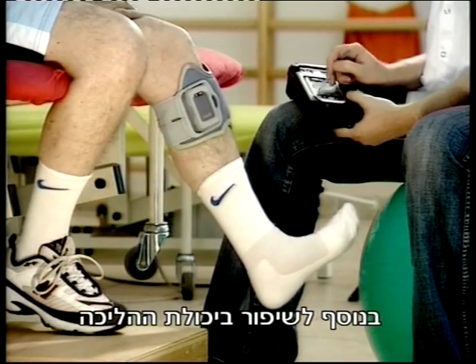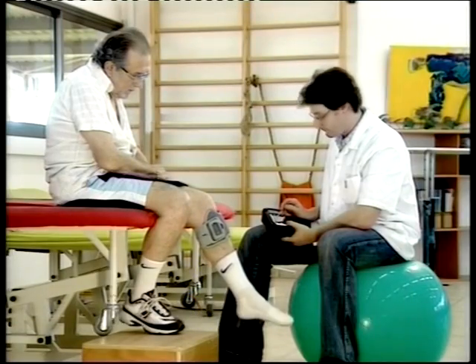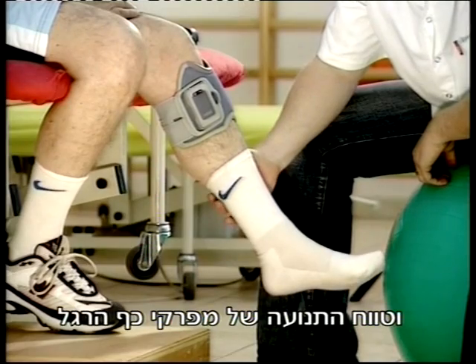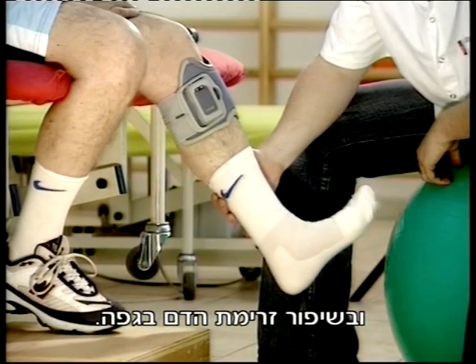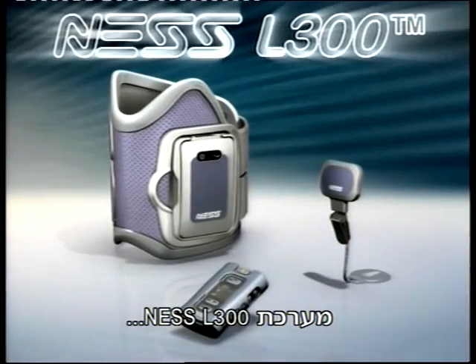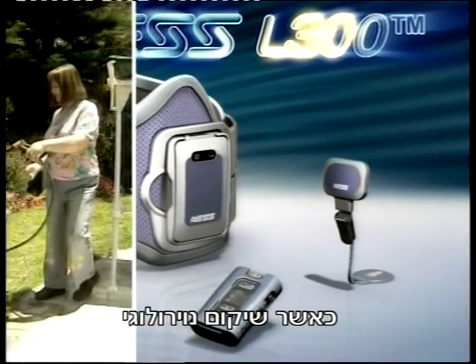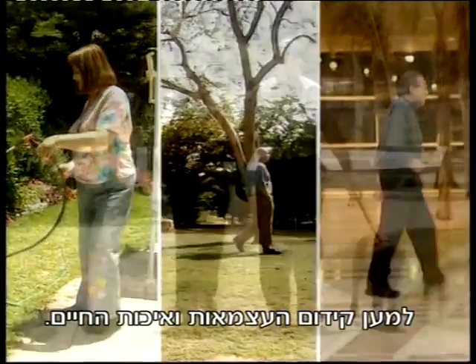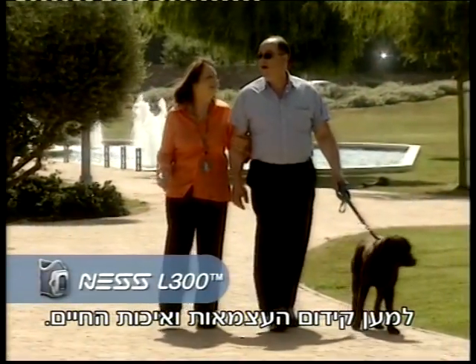Besides improved gait, the Ness L300 may facilitate muscle re-education, reduce atrophy, and increase joint range of motion and local blood flow. The Ness L300, where cutting-edge medical technology and modern rehabilitation meets to promote independence and quality of life.